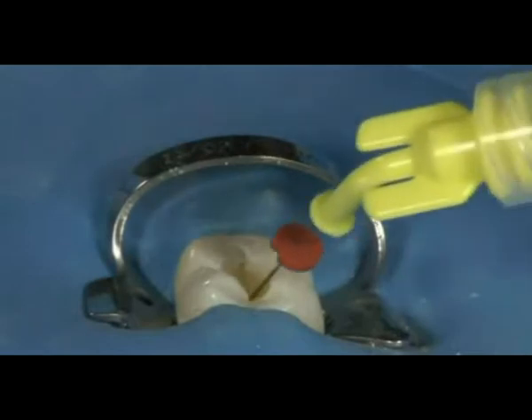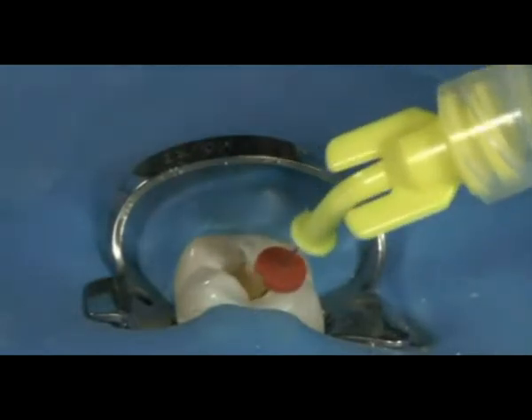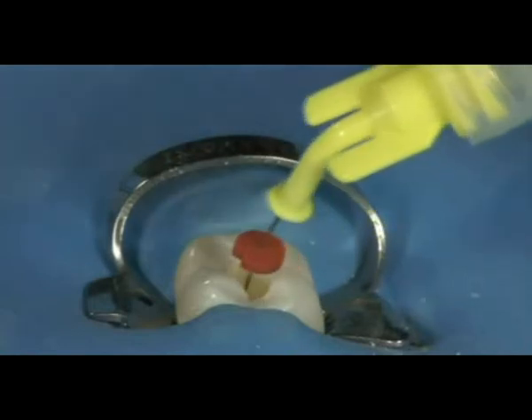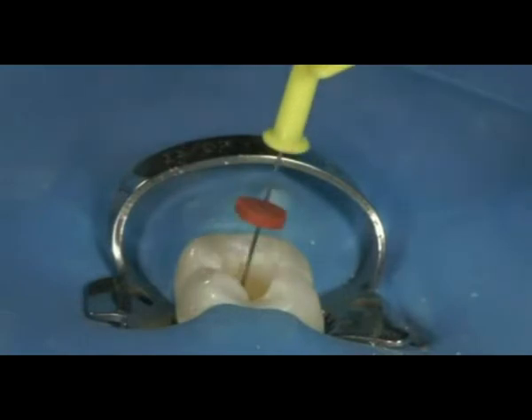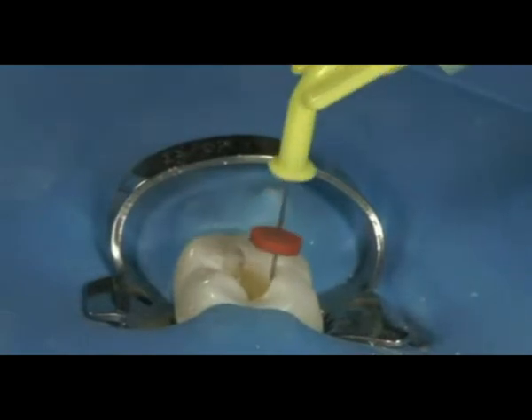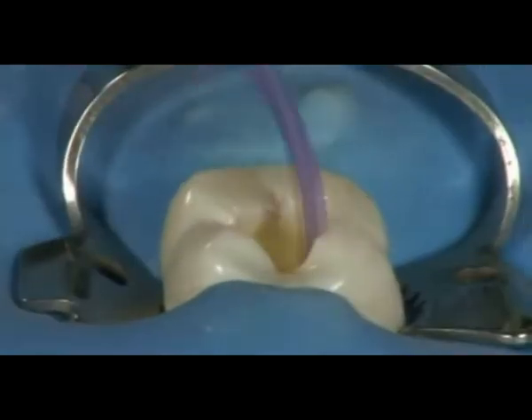Fill the canal with the liquid EDTA 18% and allow this to soak for 30 to 60 seconds. Where chloracid is ideal for removing organic matter from the canal, liquid EDTA will break down inorganic matter, such as the smear layer, and expose the dentinal tubules. Evacuate the canal.